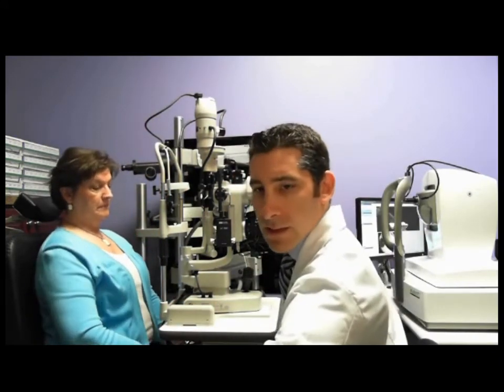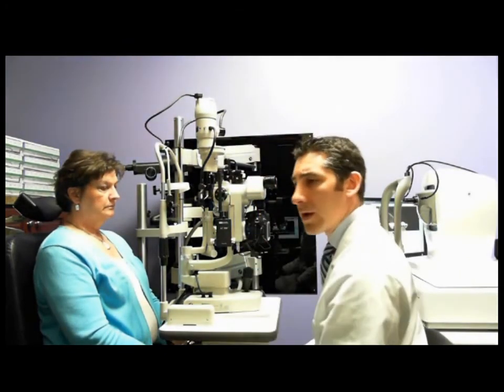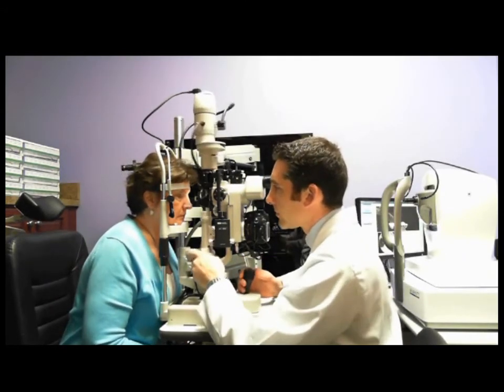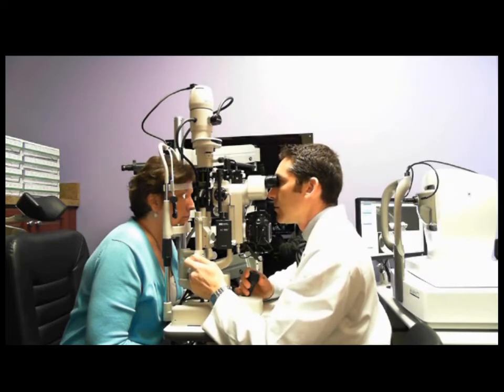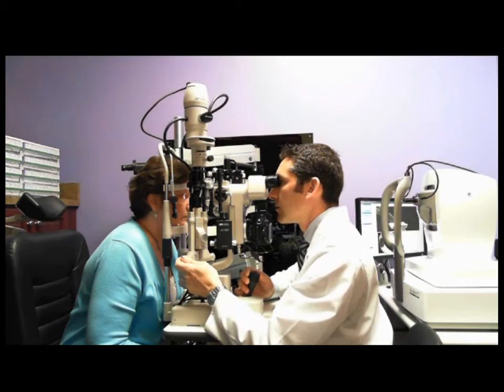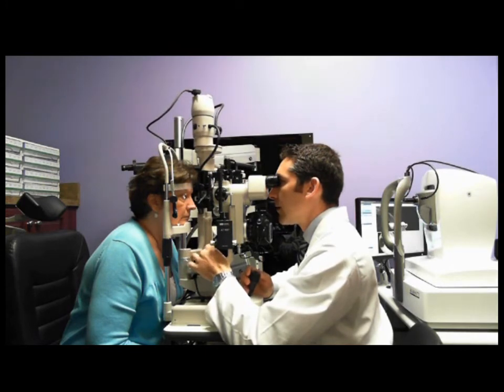We remember that when I asked her if she felt these lenses, she did notice that she felt the right one. And so we're going to try to see if we can find that. Come on back in here, Darlene, and let's take a look. We're going to go back to our optic section. See if we can identify an area, and here it is.